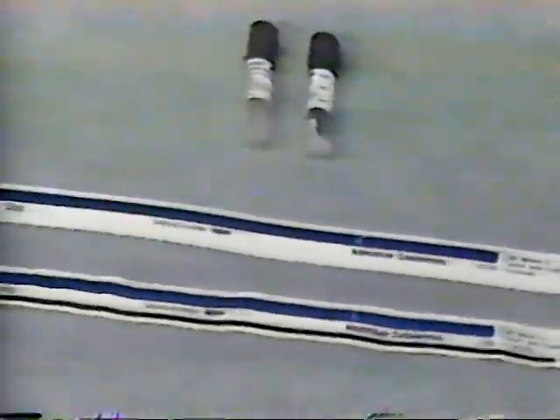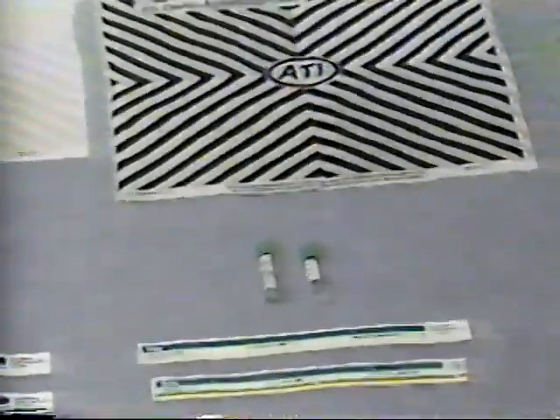To comply with external regulations, an expiration date is marked on all internally processed materials. Some commercially packaged materials may be marked with either a date of manufacture or sterilization expiration. Sterility process monitors indicate a package has been exposed to the sterilization process. Monitors can be inside or outside of the package and can be discs, tablets, solutions in small containers, or chemical tape.